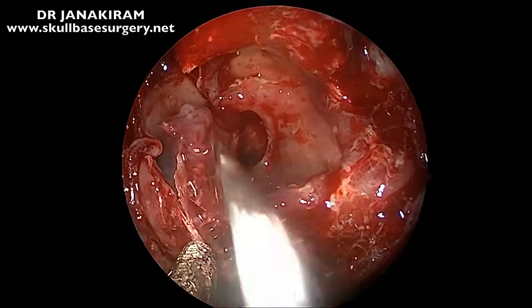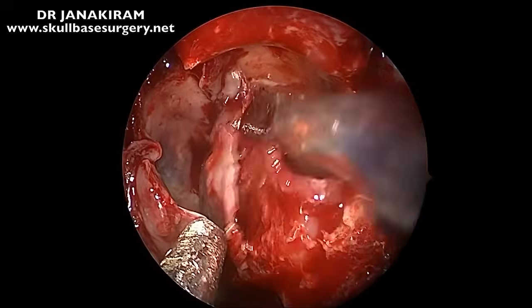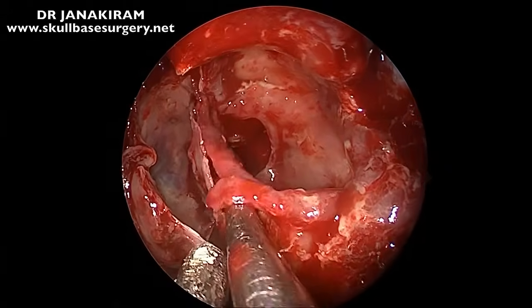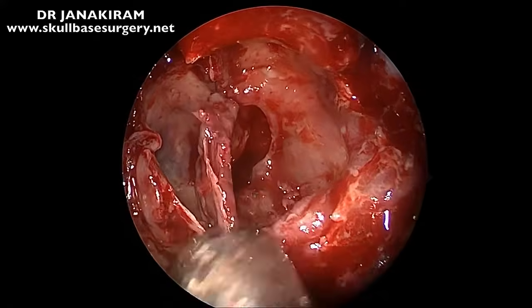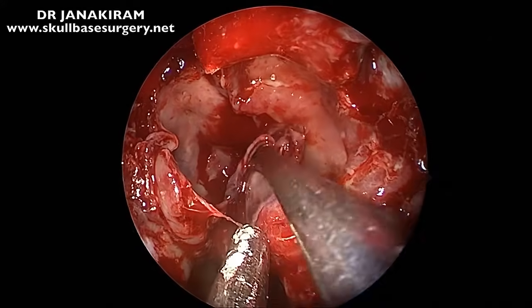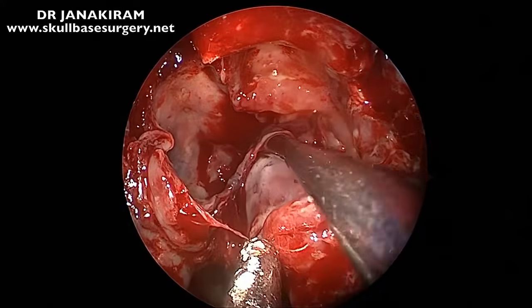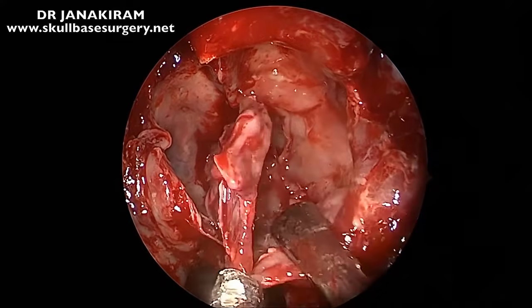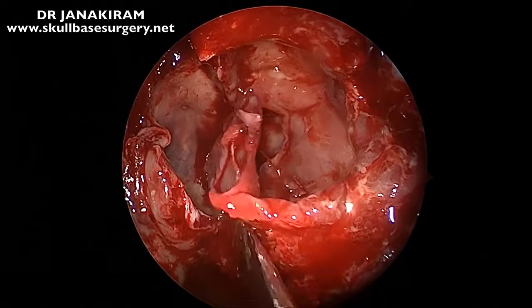And now we're trying to separate that mucosa from the bone so that we don't strip off that mucosa. If we pull that, the whole mucosa will come out. We don't want to do that, and so we are trying to remove that bone separately using a Freer's elevator to separate the mucosa from the bone.